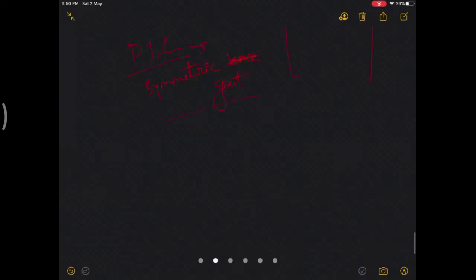And the other thing is the PCL will not allow much change; the gap created with preservation of the PCL is very little that you have to balance. So the cruciate retaining knees will not tolerate much of a joint line elevation or a depression.